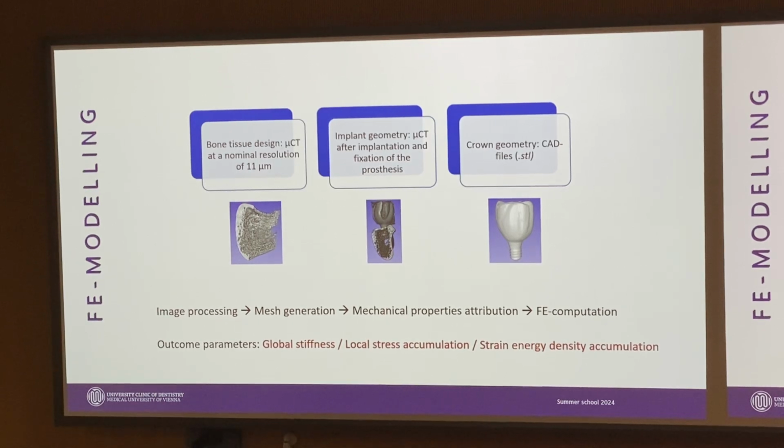digitized using an intraoral scanner for the CAD/CAM fabrication of the zirconia prosthesis, and subsequently a follow-up micro-CT was conducted to reconstruct the 3D surface of the implants, and the prosthetic construction was based on the STL files from the intraoral scan. So all processed images were integrated into a simulation model using software.